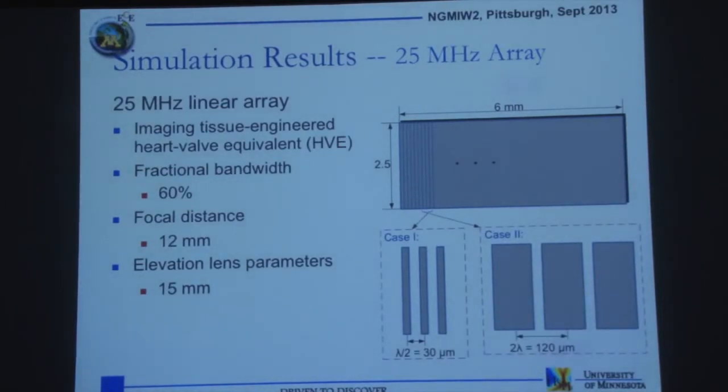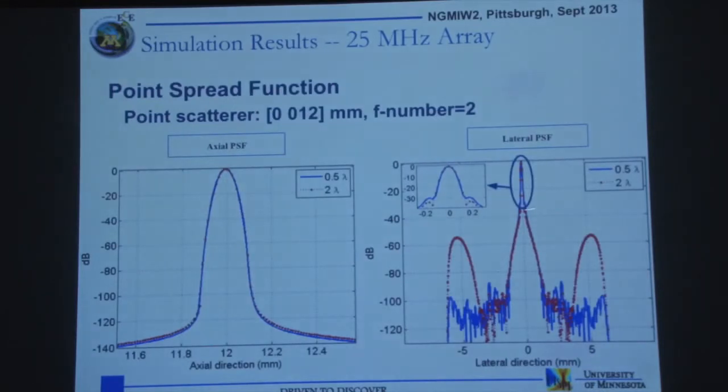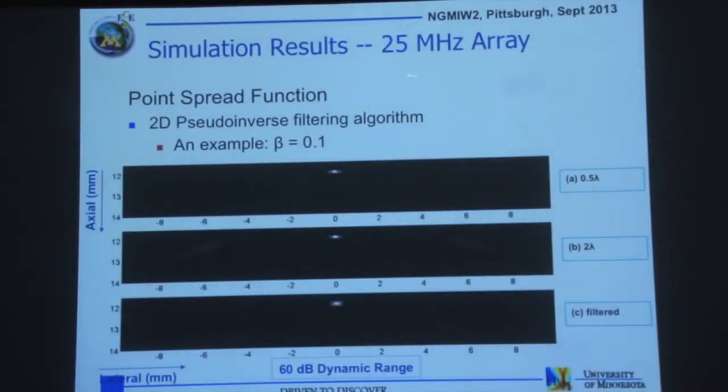So we did this as a test case. We tested with a 25 megahertz array, sampled with elements that are between 0.5 lambda and 2 lambda, just to show the kind of performance that you can expect. At 0.5 lambda, there are hardly any side lobes of the beam. At 2 lambda, you have significantly higher grating lobes that you have to deal with. And the axial PSF is about the same; there is no difference. On top is the 0.5 lambda point spread function, and the middle is the 2 lambda, where you can see the side lobes on a dynamic range of 60 dB.